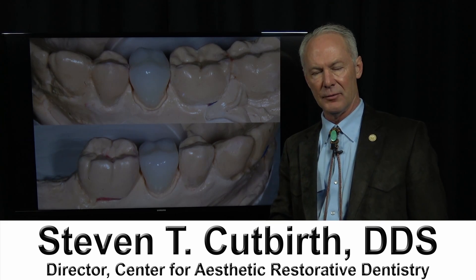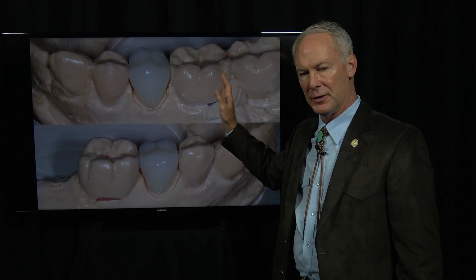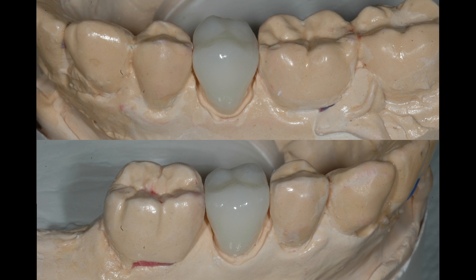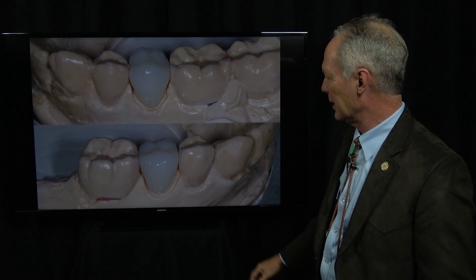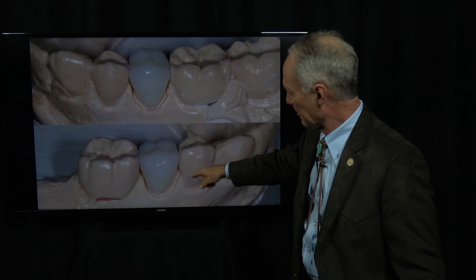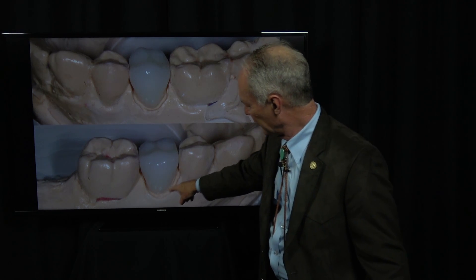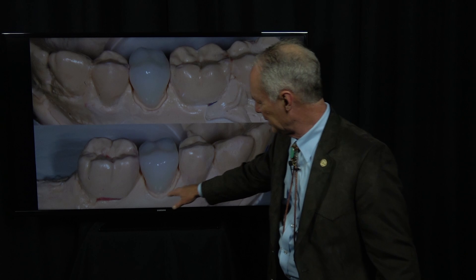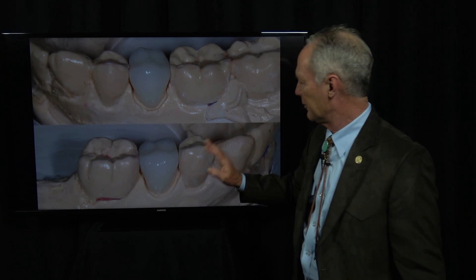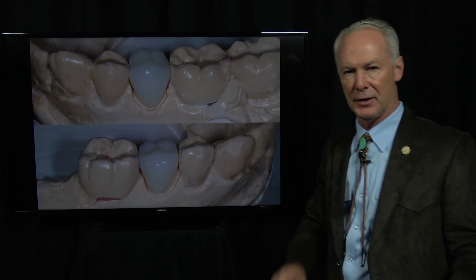Never again will you have to adjust an interproximal contact when you're seating a crown. You're going to perfect the interproximal contacts on an uncut stone model. These dies have not been cut in these models. It's a stone model and we've removed the gingival one-fourth and all the tissue part of the stone from the preparation on the stone model.